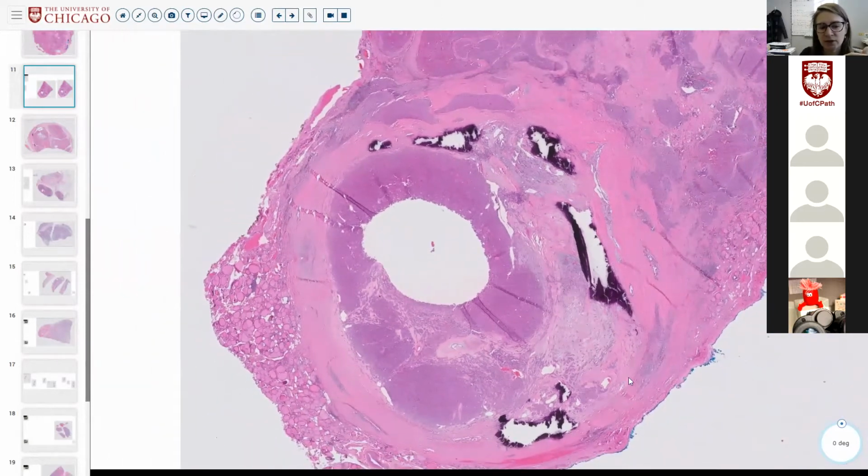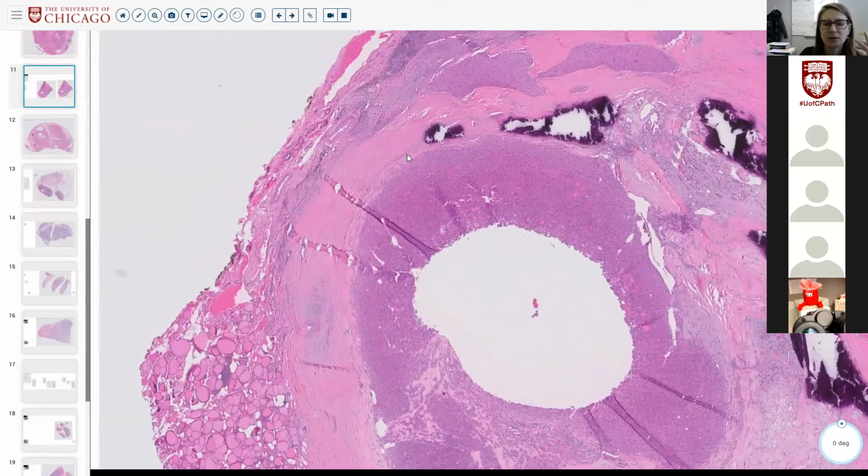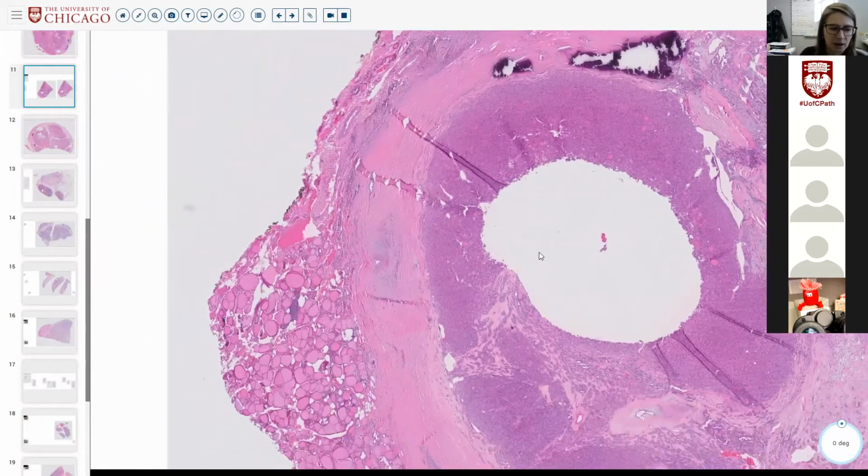What you see here are these very coarse calcifications in the capsule that they see radiographically as so-called eggshell calcifications. You can see eggshell calcifications in benign things, in malignant things. So don't let that give you a diagnosis, but at least let yourself know that there probably is a capsule here with calcifications, and just evaluate that capsule thoroughly if you see those.